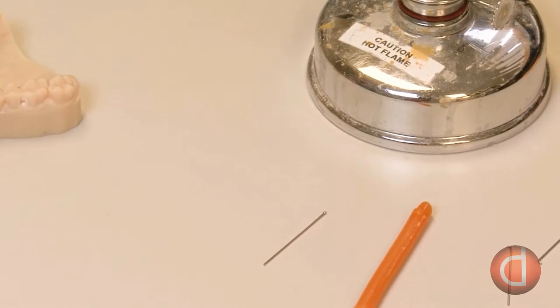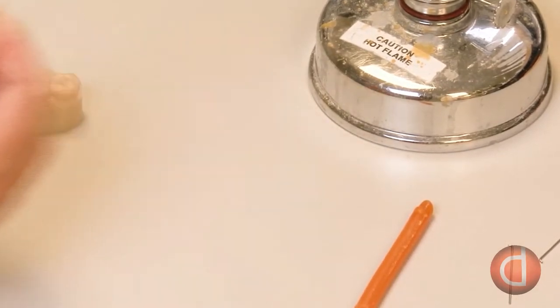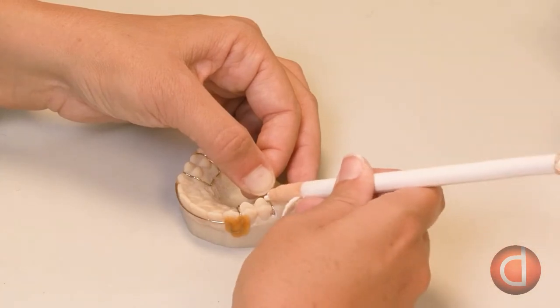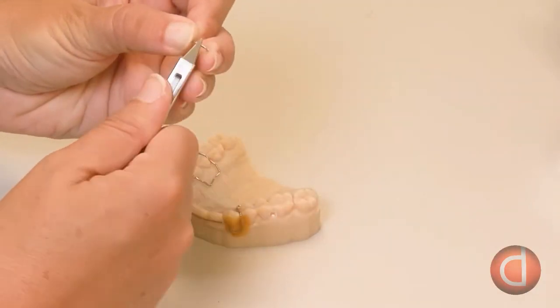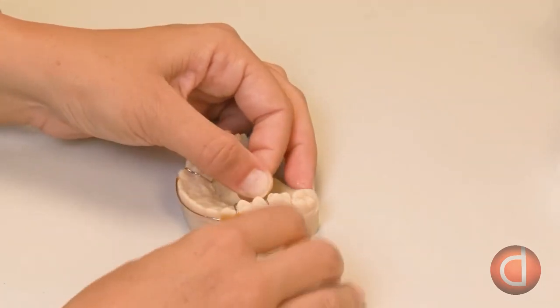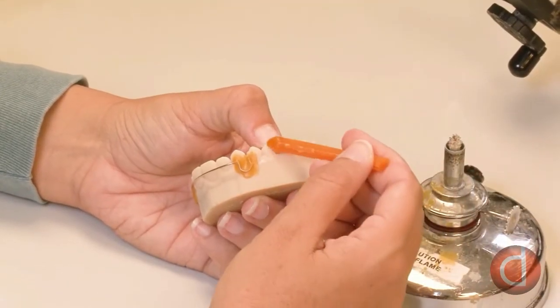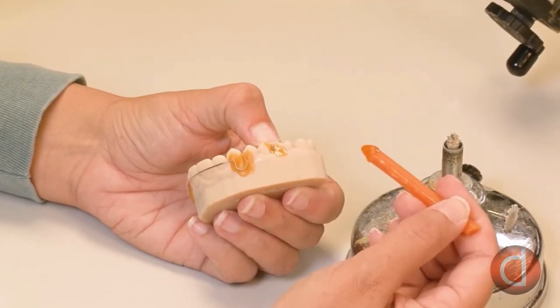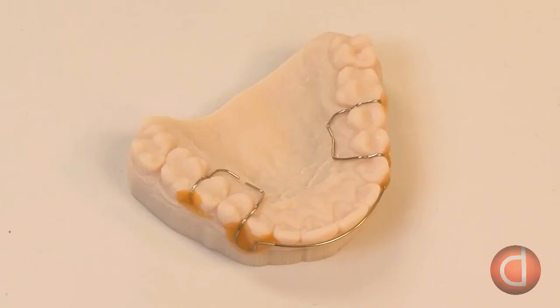A key component to retainers is retention — clasping is added to keep the appliance in place when worn. A set of ball clasps are added to the front of the molar and contoured to the interproximal space between the teeth and into the palate using single beak pliers. Once completed, the technician keeps the clasp in place using sticky wax. With the wires firmly in place, the model is now ready to pour acrylic.